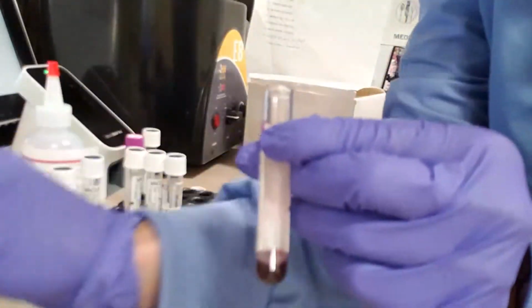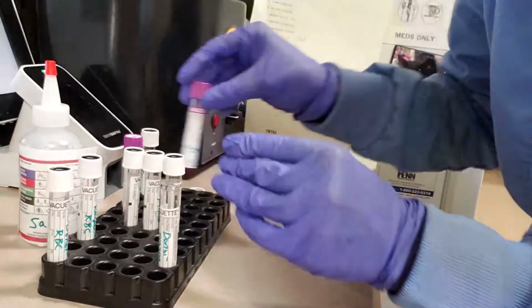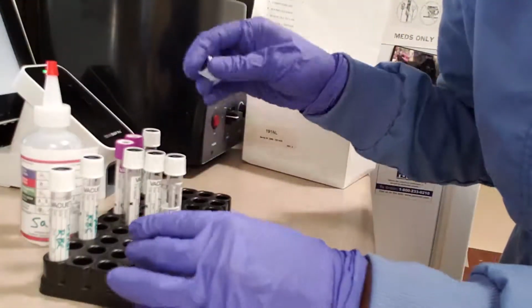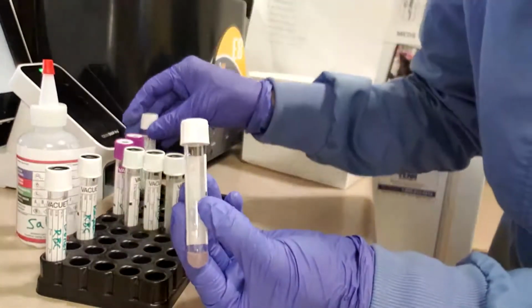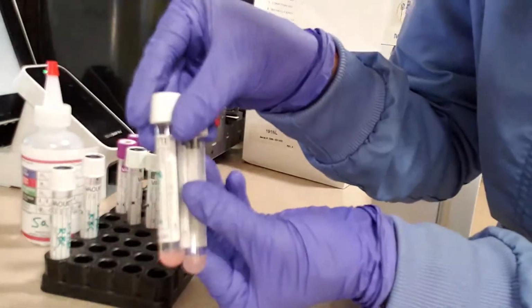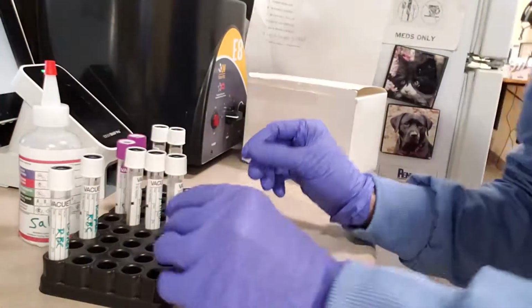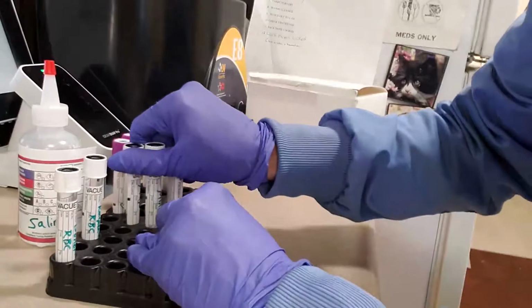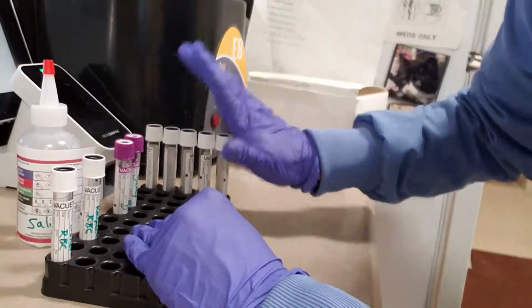All right, discard that, and then we'll hold on to this for just a second for our next step. So now we have our donor plasma and our recipient plasma. We'll put those off to the side for just a second, and we'll get to these in a second as well.